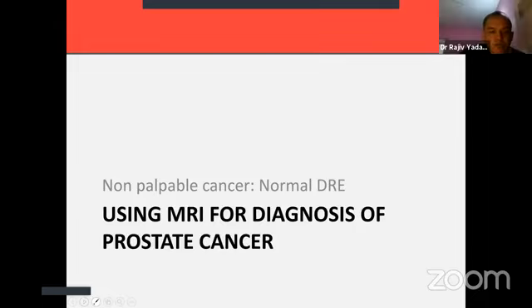All right. So here I have included some examples where I will show you how MRI helps us in better decision making using this information. So the first scenario is a non-palpable cancer, with a normal DRE.